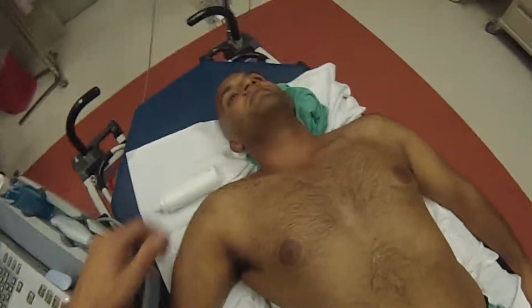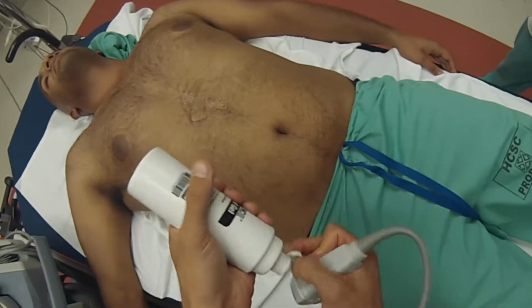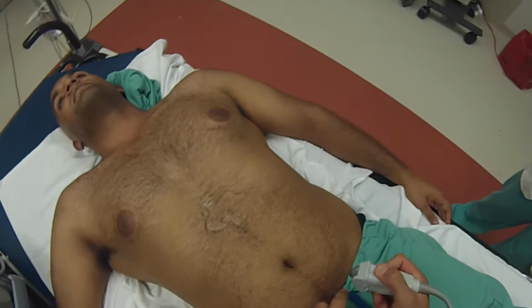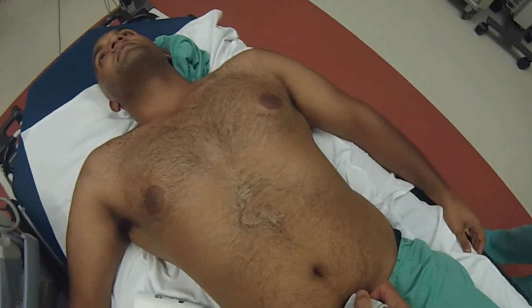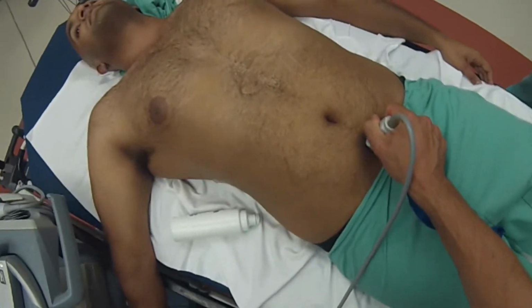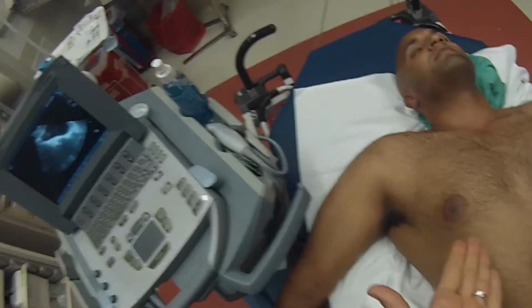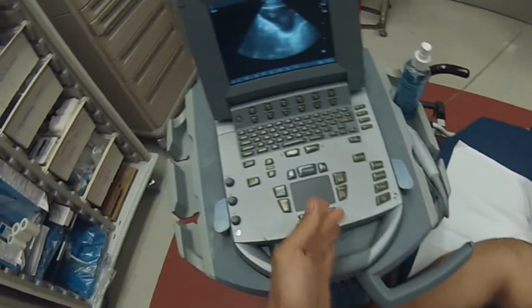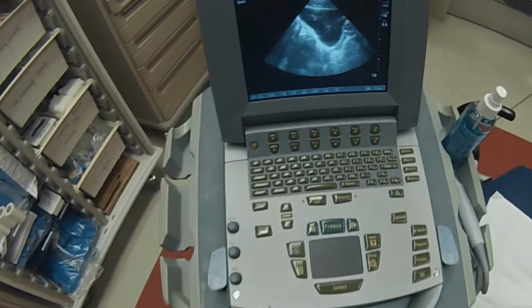Of the abdominal part of the FAST is your pelvic views. And the three things you're going to look for here are fluid to the sides of the bladder, behind the bladder, and below the bladder. So here I am in a sagittal plane. The indicator is towards the patient's head. And I am going to catch the bladder in a sagittal view, as you can see here.